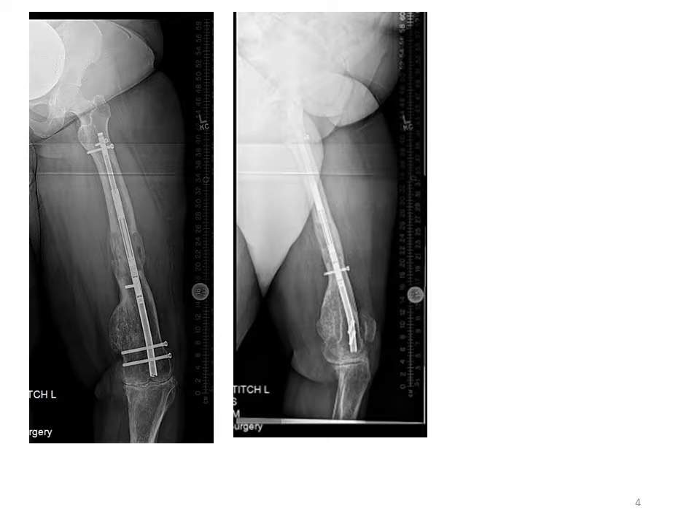Lengthening then proceeds at a rate of a millimeter per day. And what you can see on this AP and lateral x-ray is the consolidation of about 7 centimeters of new lengthened bone. This has led to a substantial increase in length from the deformity correction and from the actual lengthening.